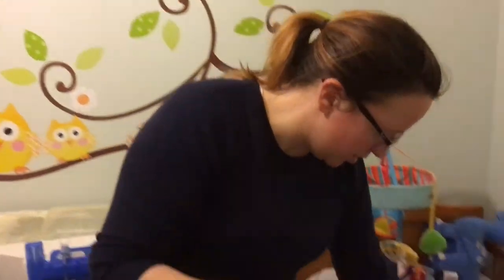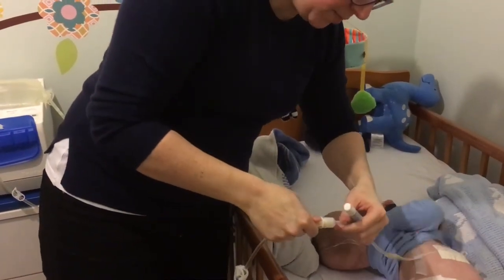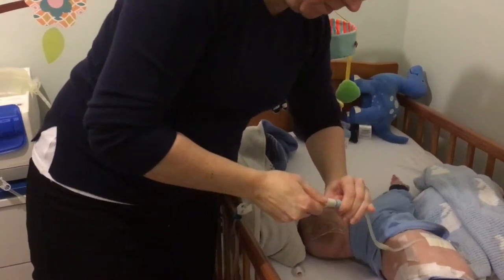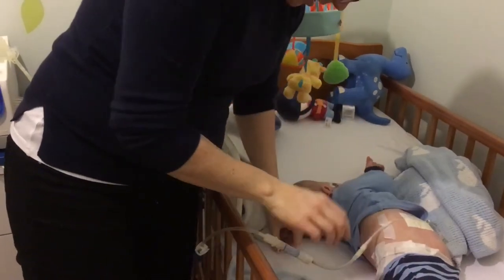So here — this is the patient line, which is about to attach to Ethan's tube. Again I'm not going to talk while I'm doing it, just because of the infection risk. Okay, so that's connected now — let me just undo this clamp.